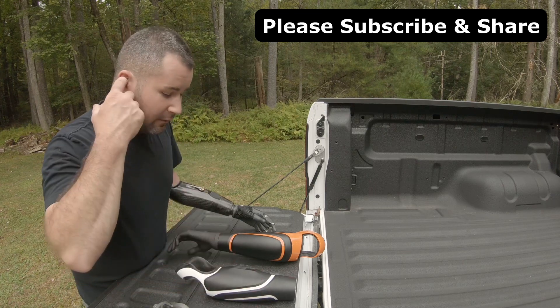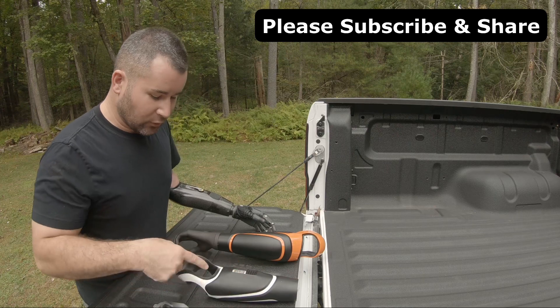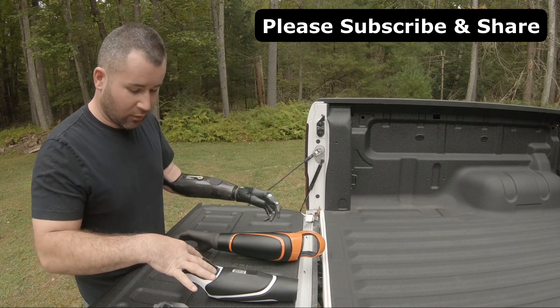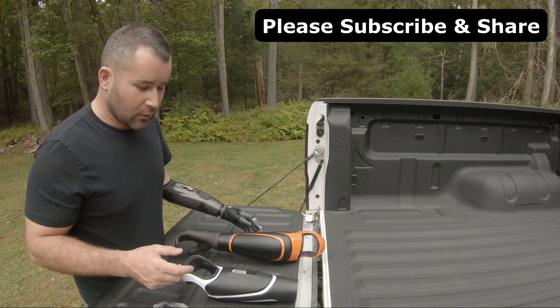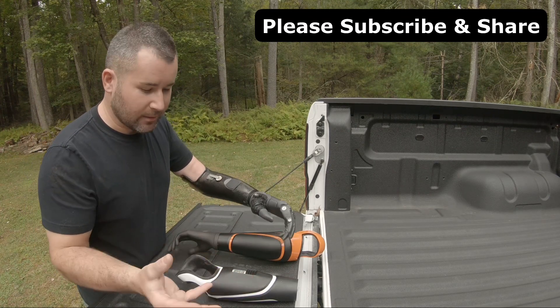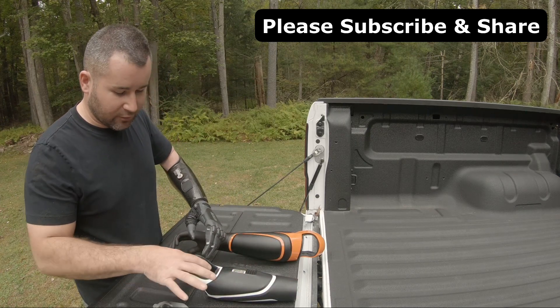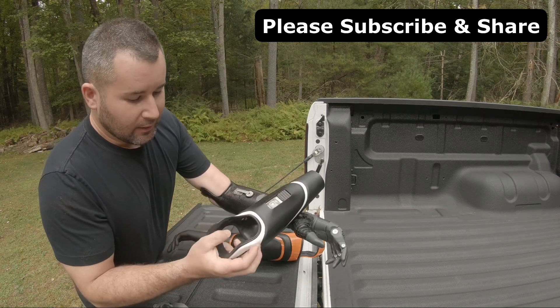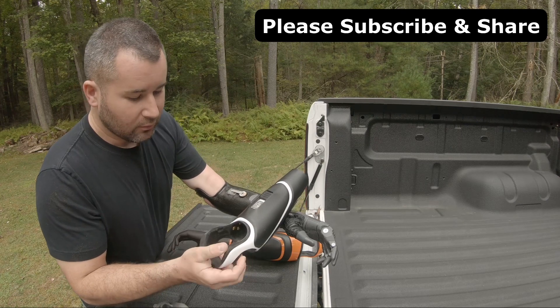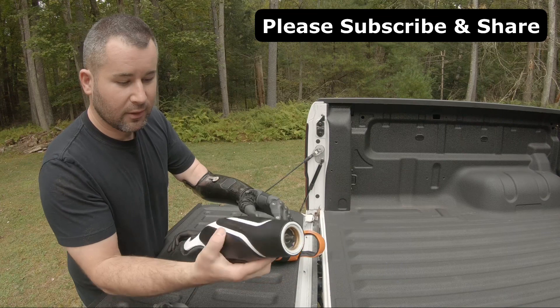They're out of Poland, I believe. So Glaze gets your measurements and your mold, and I don't know exactly what they do on their end, but they set it all up — the socket is 3D printed — and your socket that was molded gets fit right inside of the 3D printed arm.